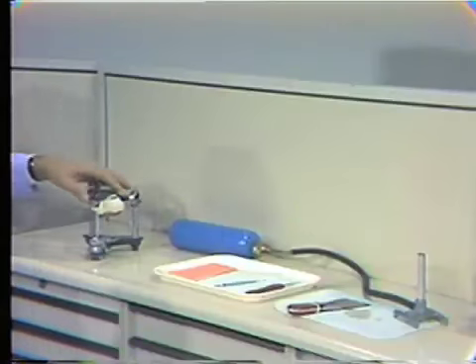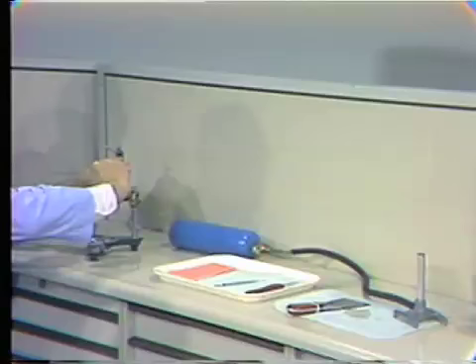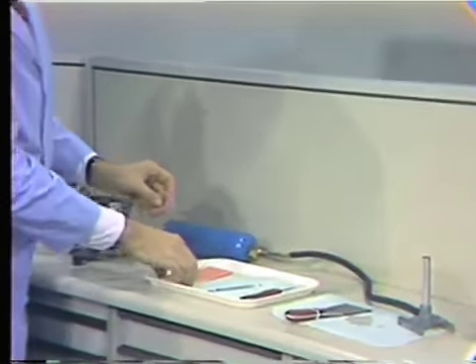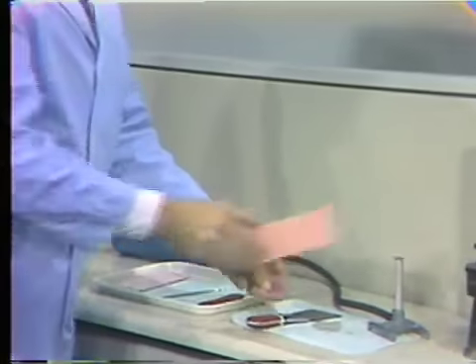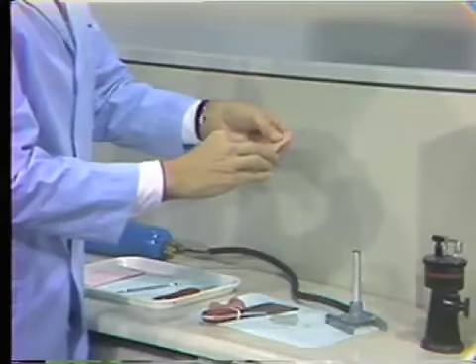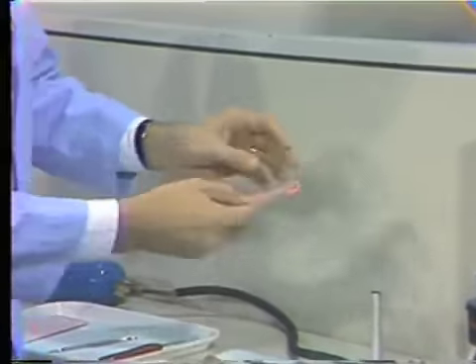We will now, with this wax occlusion rim, determine our vertical dimension of occlusion using the maxillary base plate and soft wax. We will remove the base plate from the cast, which has been mounted by the face bow, and with one sheet of pink base plate wax, we will soften over our flame and roll it into a roll, which we will attach to that base plate.